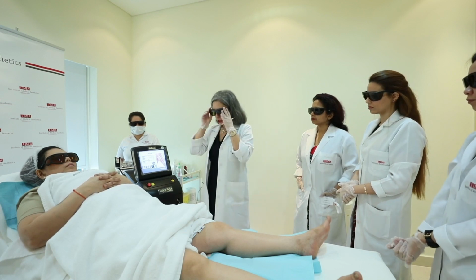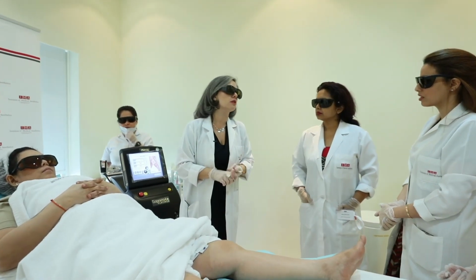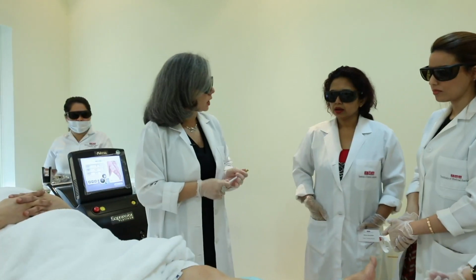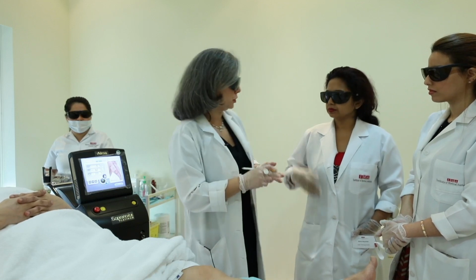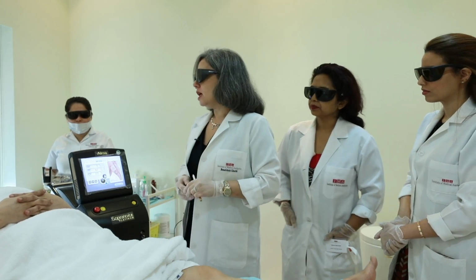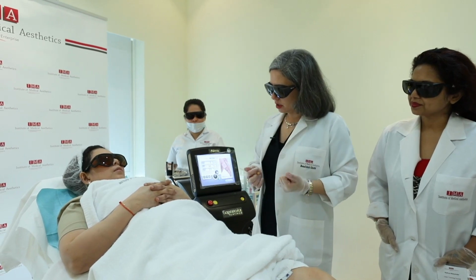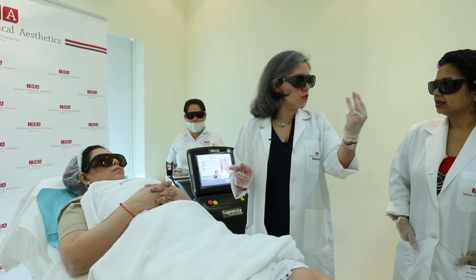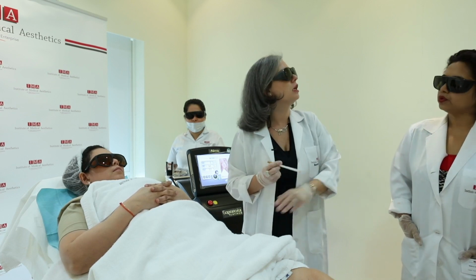Now that you come to the patient, what is your first responsibility? Determining the patient's skin type. So, give me skin type. What do you think is her skin type? 3. We can never be sure whether the patient is 3 or 4 unless we ask the question. Ms. Raquel, what happens to you when you go to the sun? If you're exposed to the sun, do you get red initially? Yes. People who say red, they are 3. If her answer was no, I tan easily, then she would be 4.